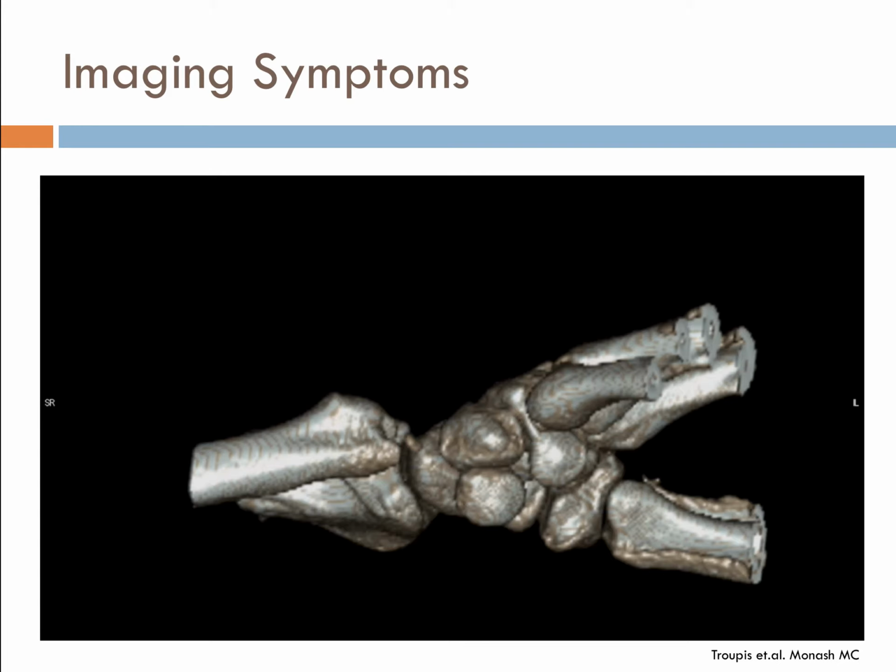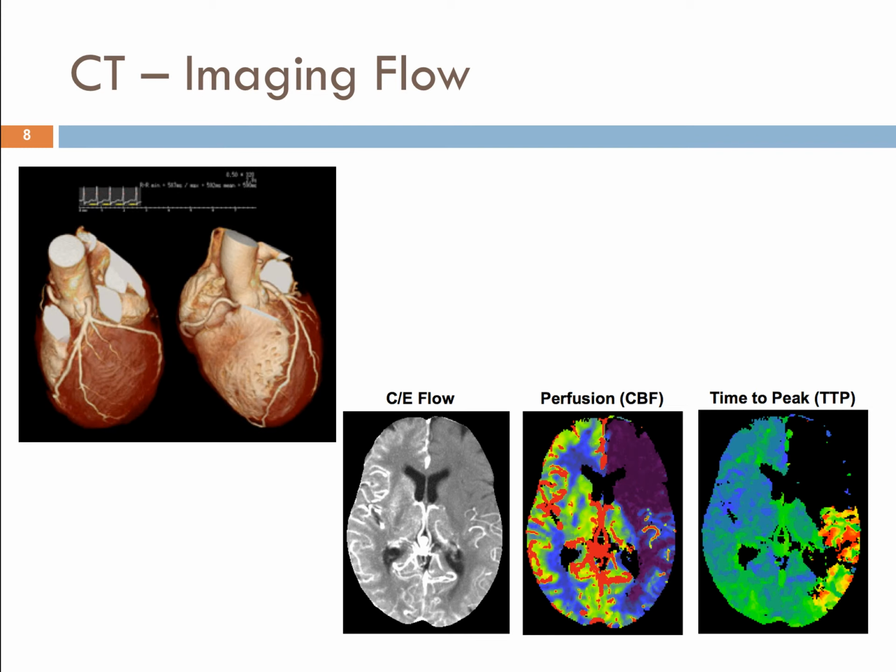And this will be a powerful force too, as we develop algorithms that allow us to do this using a lot less radiation, much less than what we use now. This sort of field, this dynamic imaging, is going to go along in leaps and bounds. It really will. We can also use CT imaging to image flow.